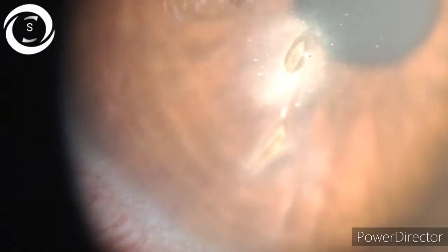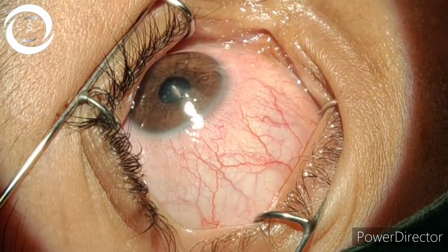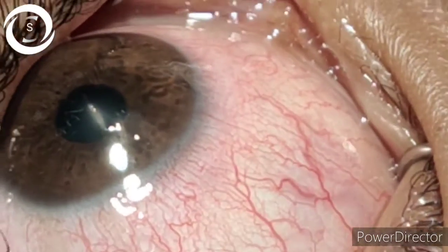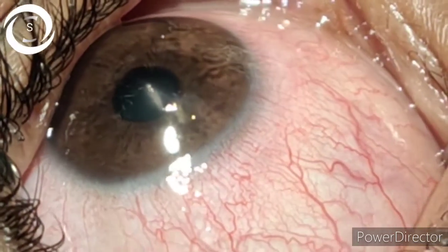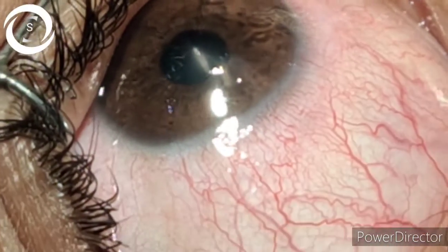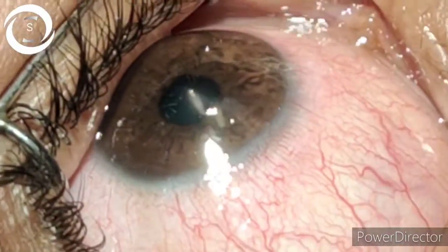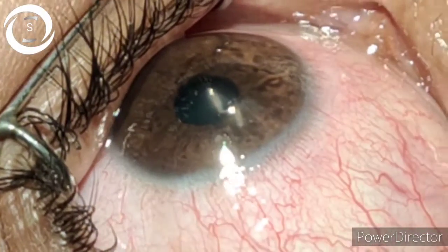But these foreign bodies should not be removed on the slit lamp like routine foreign bodies. We have to remove them in the operation theater under proper conditions. So I took the boy to the operation theater, and under the operating microscope but still with topical anesthesia, I tried to remove those foreign bodies.